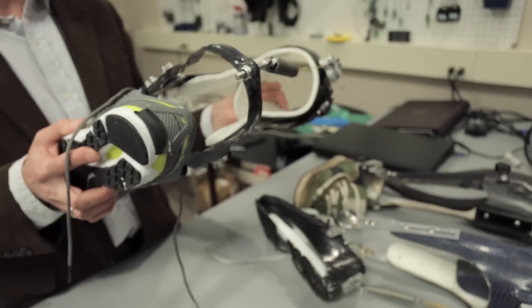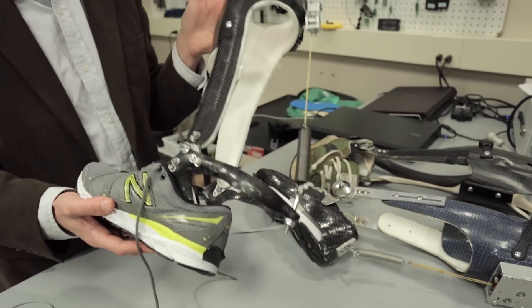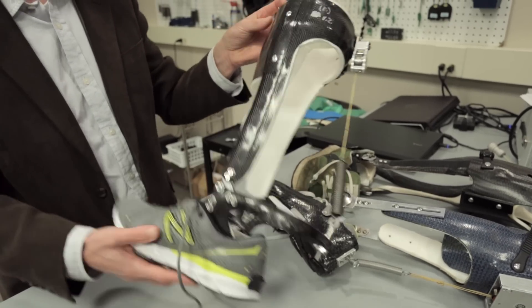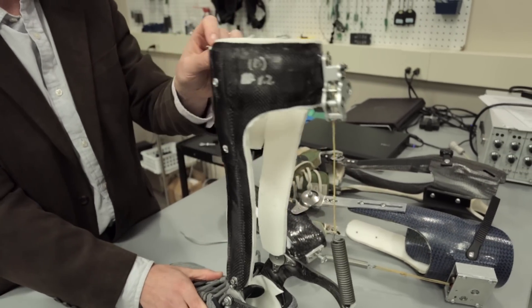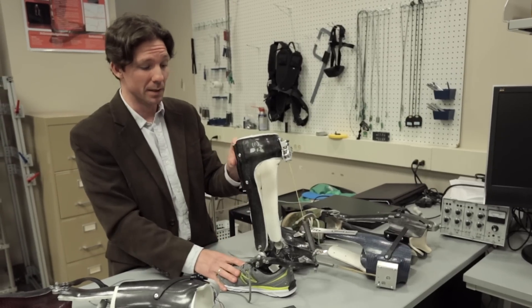People with strokes or spinal cord injury could benefit from having this parallel pathway for musculoskeletal load to travel that's not then put on their bones and ligaments, and doesn't require their muscle coordination to be perfect. So the results with this have been really promising.